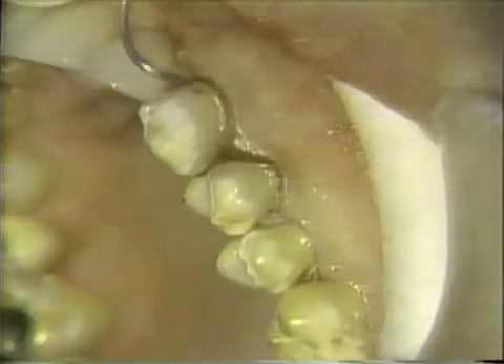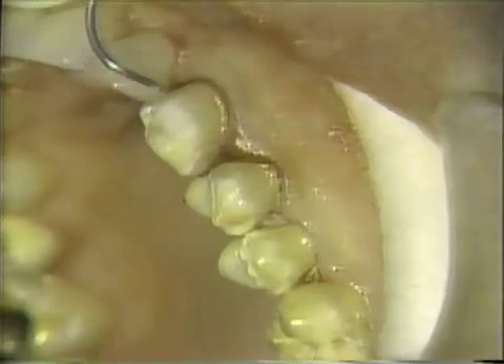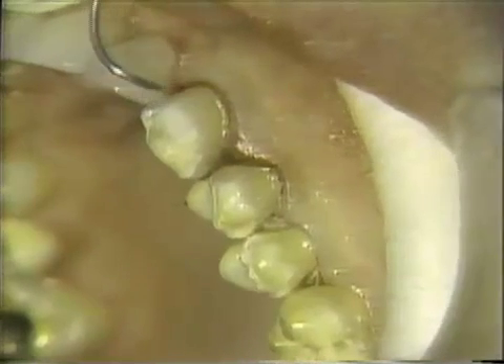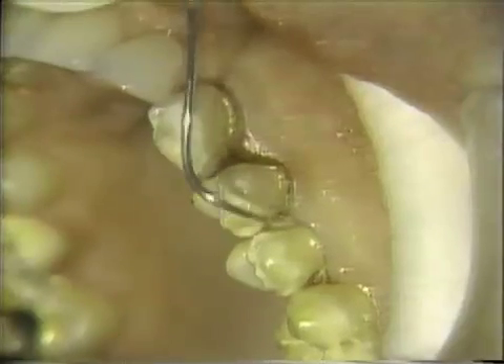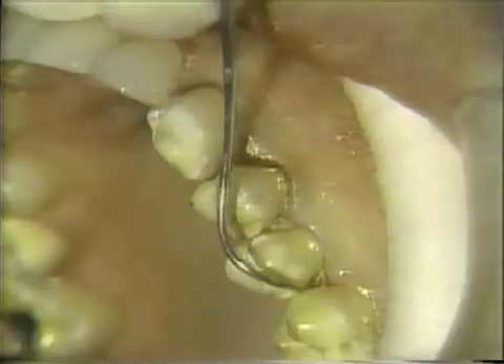Now you can see the details of the preparation, how it's tucked in the interproximal, and how the cervical goes under the soft tissue, and the details of the occlusal finishing line. From the mirror shot, you can see the details of the occlusal and lingual finishing line also.